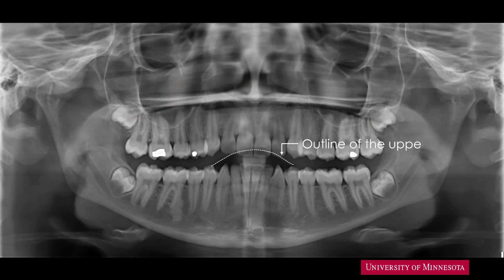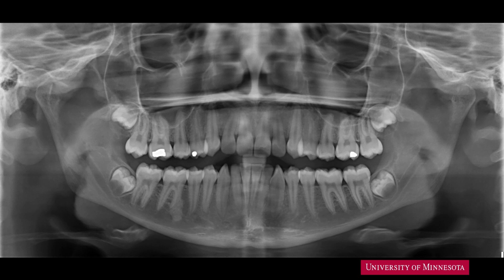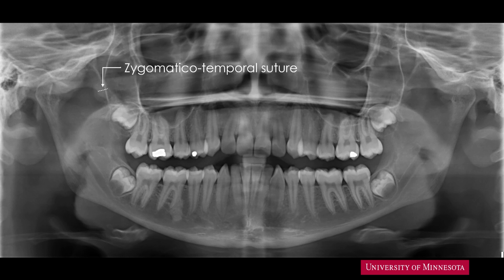Superimposed over the maxillary incisors is a curved line of contrast — this is the outline of the upper lip. As we had identified in our intraoral radiographic anatomy video, we can identify a radiolucent line representing the zygomatico-temporal suture.